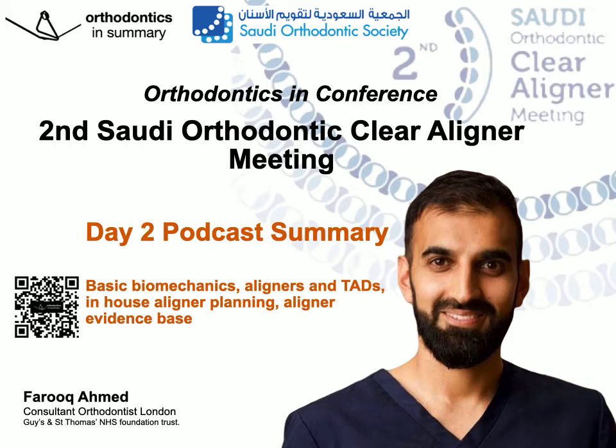Now, Renato described synergistic movements with aligners, and he mentioned that these are the most predictable types. For example, extrusion and retroclination are things which work well when it comes to aligners. And also with fixed appliances, these 2 movements relate to each other, as the biomechanics are complementary when it comes to the distance of force application from the center of rotation. Now, what Renato described as being challenging movements are the standalone movements. And he mentioned a way to make these more predictable.